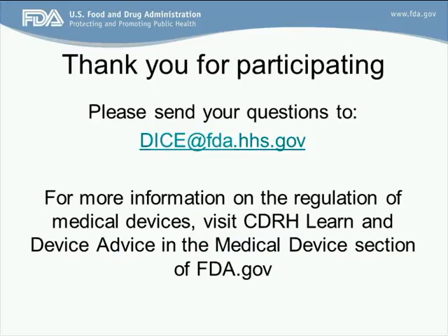My question was, would these devices for home use be given an Rx/OTC designation? What type of designation? Prescription or OTC designation, or both? They can be both. They can be prescribed or they can be over the counter. We're looking at both because so many devices that were prescription before and just being used by healthcare professionals are now going home with the lay user. So we have to address that particular area, understanding that devices are migrating into the home quite frequently. Okay. Thank you. That was my question.